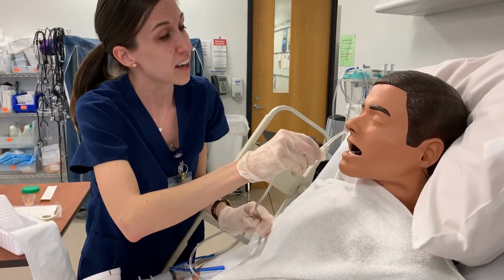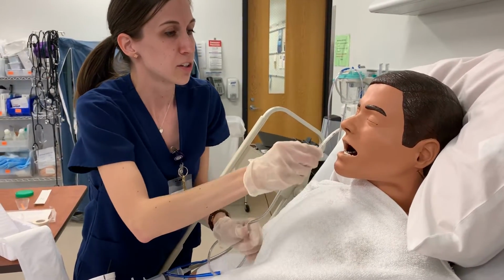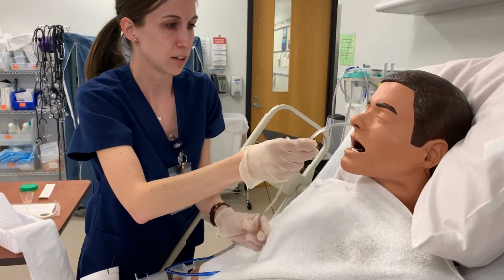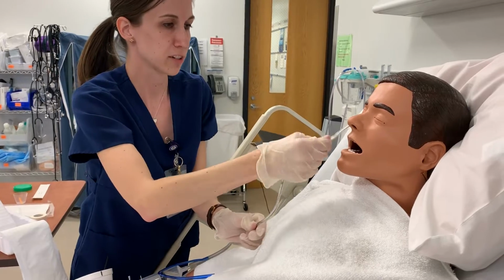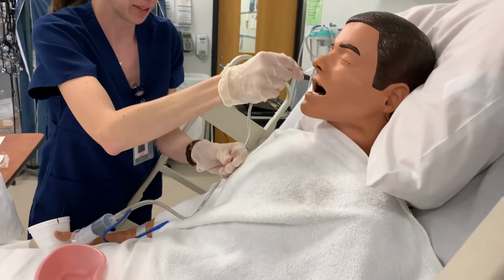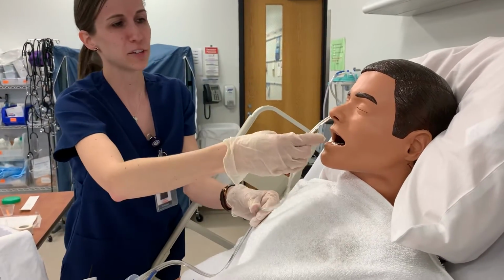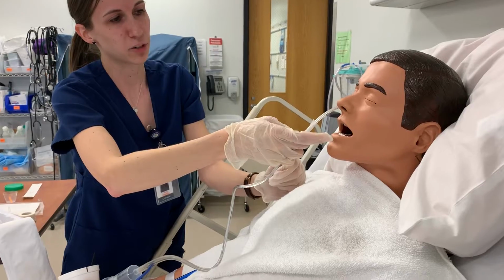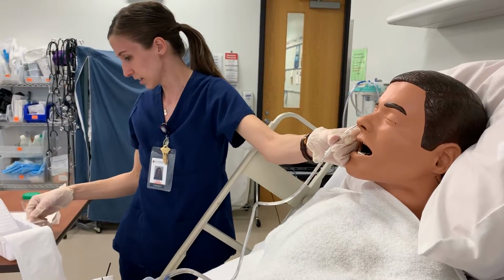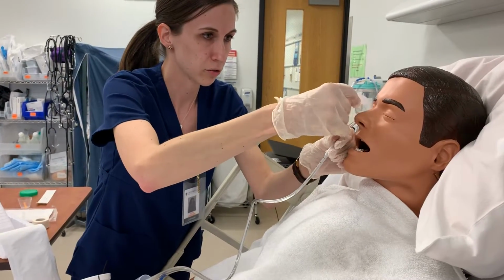And then I'm going to ask that every time you swallow, I'm going to be advancing the catheter. So swallow, swallow, swallow, swallow. And I'm going to be doing this until I reach my marked point of my nasogastric tube. And sometimes our mannequins don't go all the way to the point that we measured, so the best you can, but I would advance until where I have measured the catheter. I'm going to make sure to secure that catheter until I can tape it down so we don't lose it. I'm going to place that over their nose.